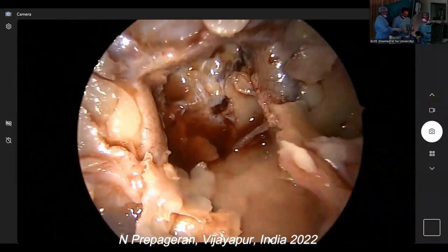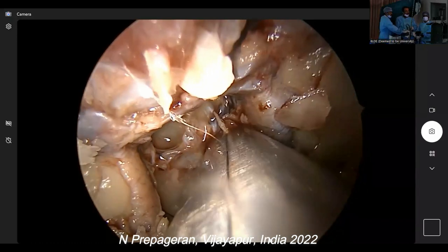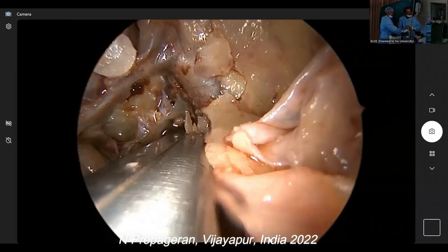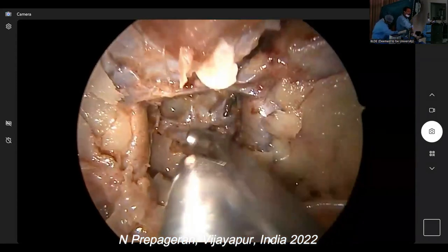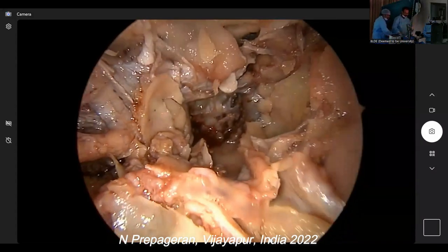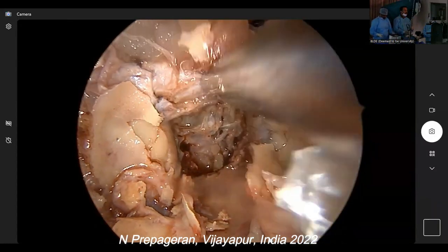Okay, I'm going lateral. The same way, I'm going lateral here as well. Can you see, guys? Yes, sir. We can see it clearly. It's to accommodate my hand movement. So you see, I'm going laterally like this. Okay, good. So when you open the dura, you go back to normal. We are all along the floor. So this is a difficult transclival because the space is very small and the bone is thin. But you see a difficult one being done, then the rest will be easy for you.